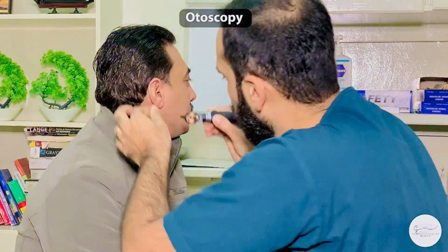The things that we are looking for is if there are any perforations on the surface of tympanic membrane, what is the color, is it dull or congested, if it is bulging or retracted, and we can also check for the mobility of the tympanic membrane. In order to do that, we ask the patient to do Valsalva while having an otoscope inside the ear.